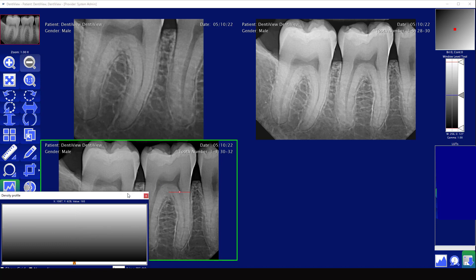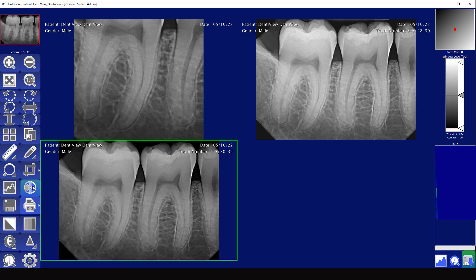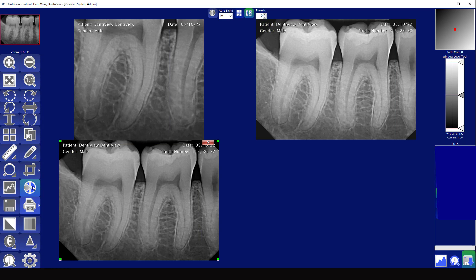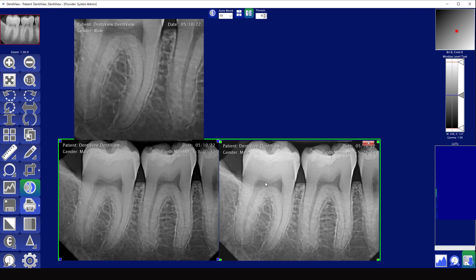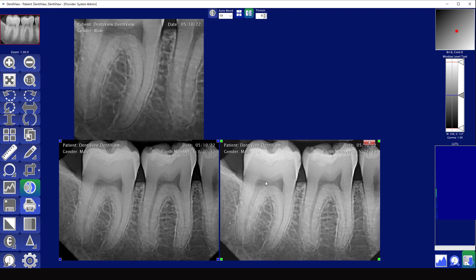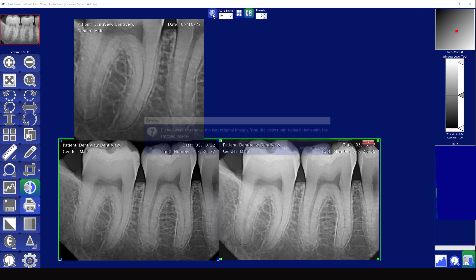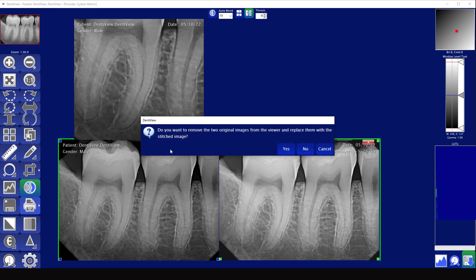The next tool is a stitching tool. This allows you to take a single image, put it next to a second image, and then combine them into a single image — making it so it's like a bitewing side-by-side as a single image.